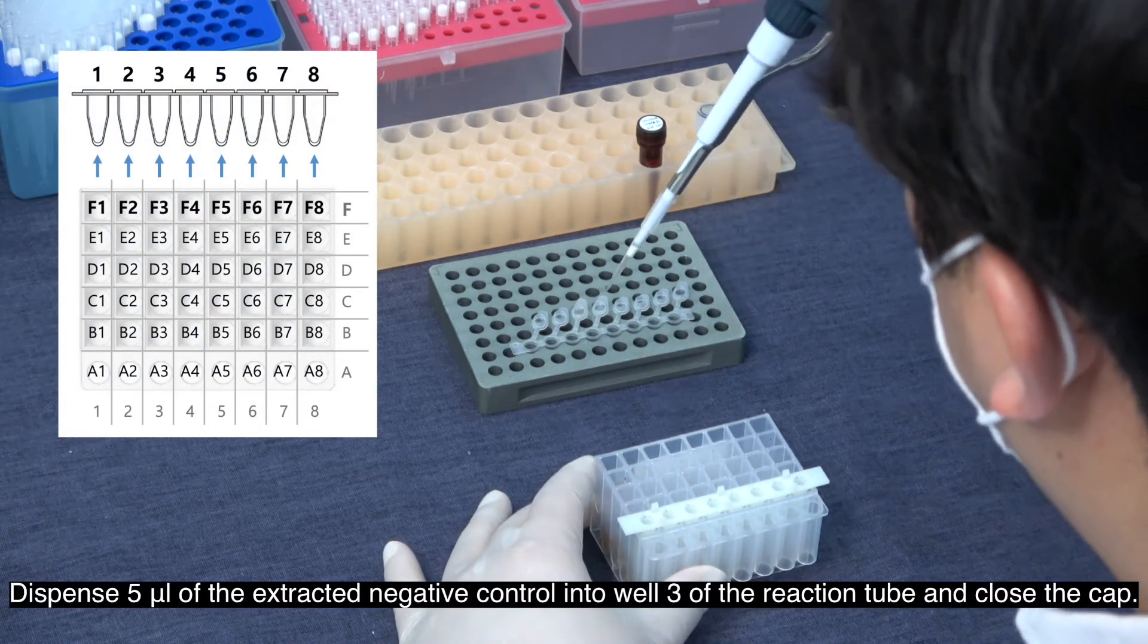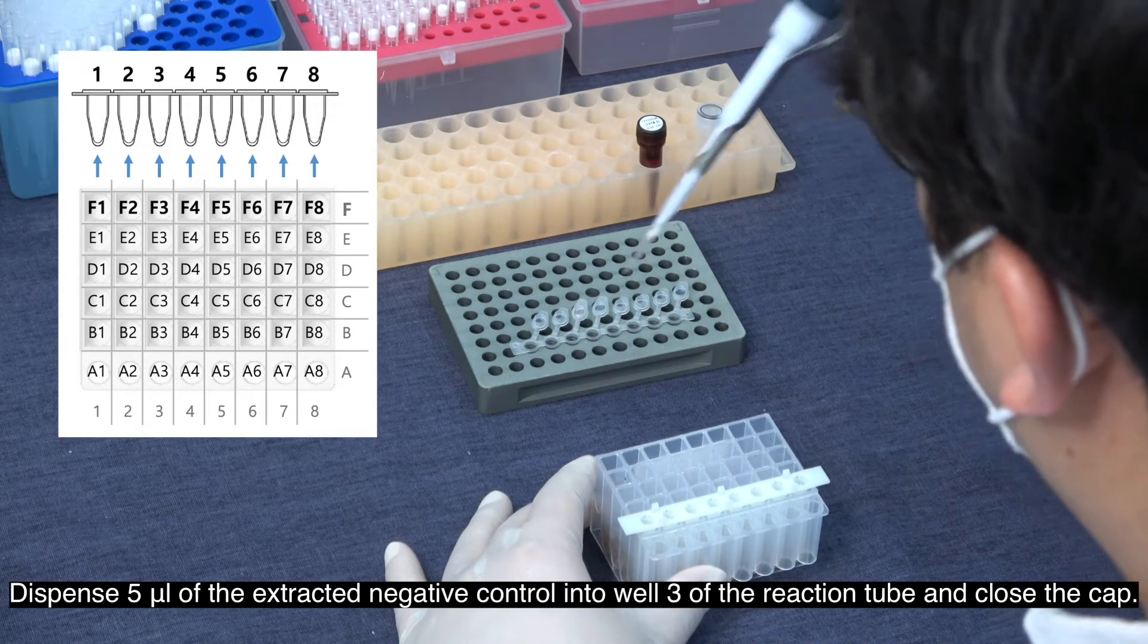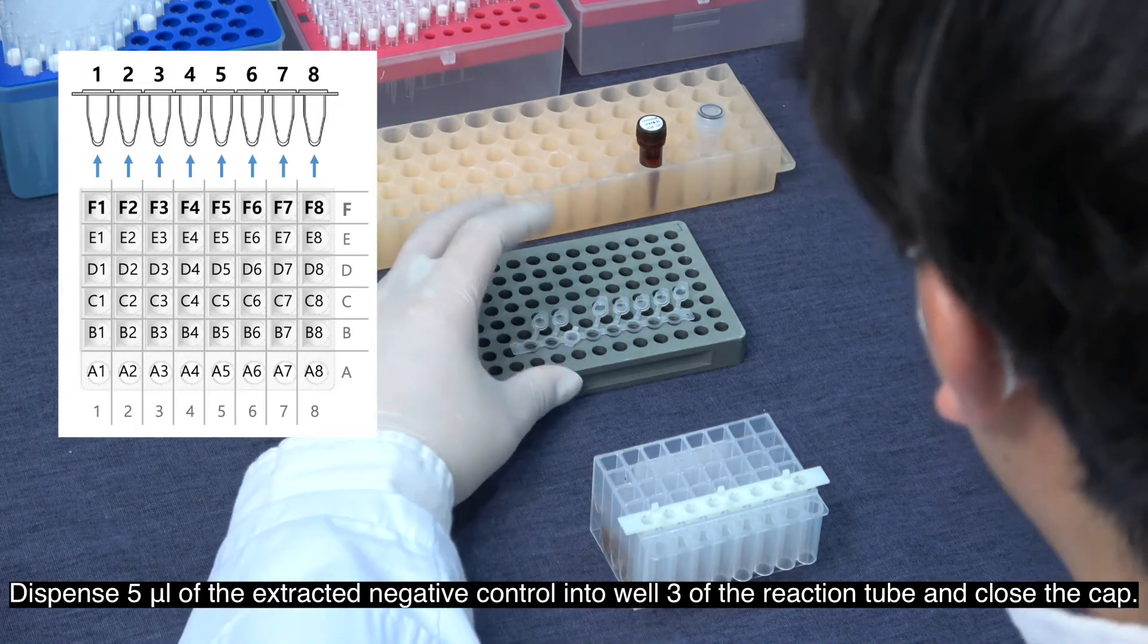Dispense 5 microliters of the extracted negative control into well 3 of the reaction tube and close the cap.